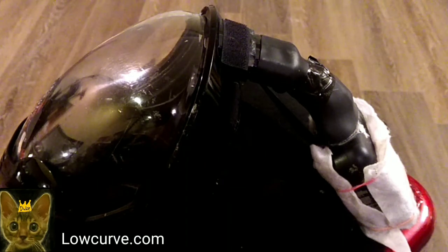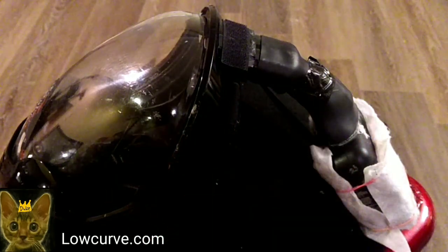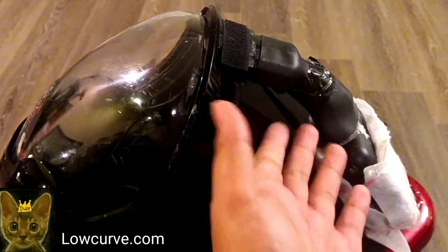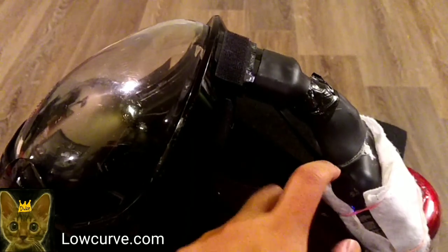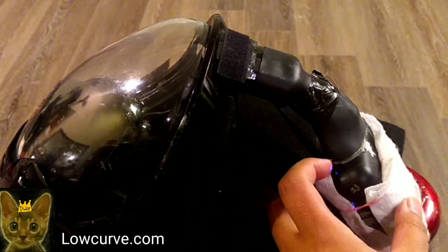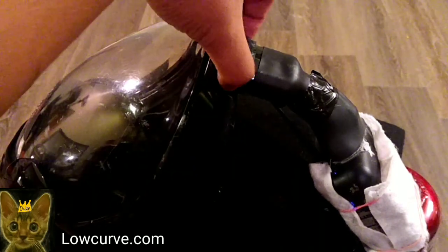But one note on the glue, make sure you give all of the connections, everything here, the glue, everything, a good amount of time to fully cure. I'd say give it 12 hours. Once it's all built like this, before you start using it, give it 12 hours for everything to fully cure, and then let your fan run on full for a while, just to clear out any off-gassing that might have happened in the process.